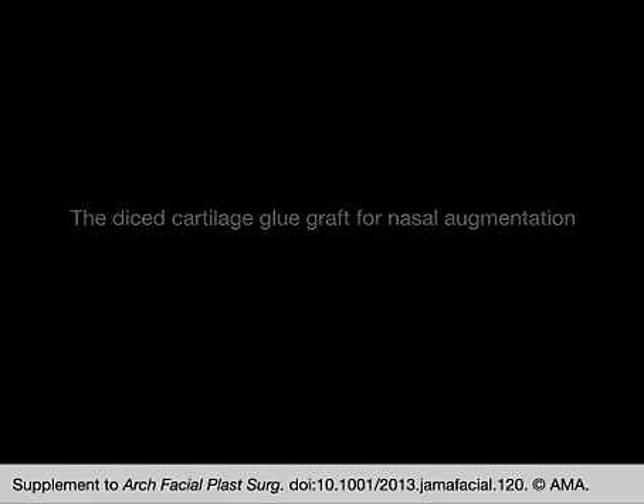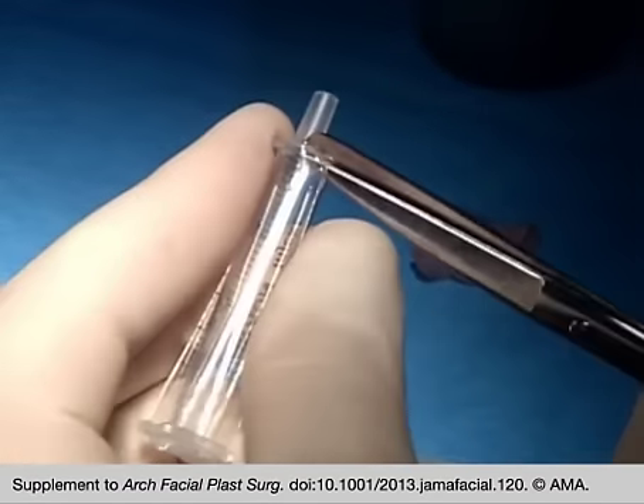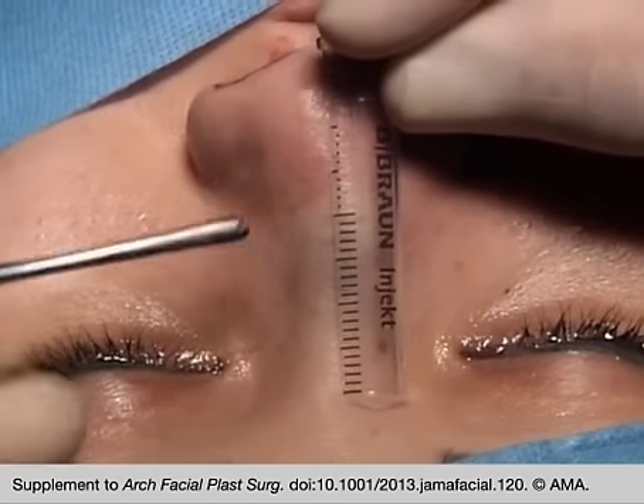Hi, this is Ebel Jan Tasman from St. Gallen, Switzerland, showing you how to prepare a diced cartilage glue graft. A syringe with the suitable diameter is cut in half to serve as a mold.